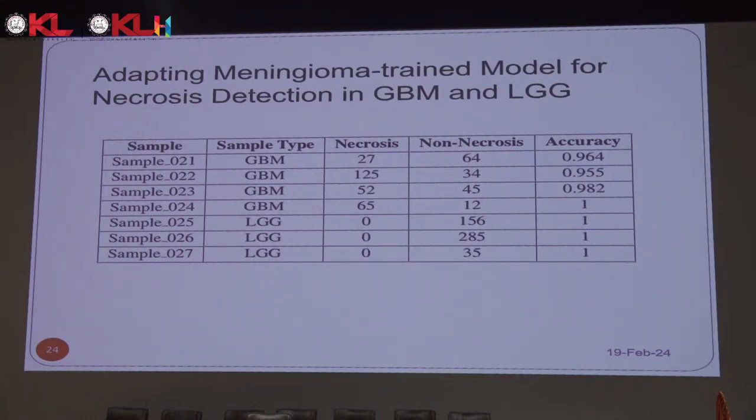Dr. Rose was speaking about glioblastoma on the radiomic side. We are trying to do it on the histopathology side. The TCGA has glioblastoma slides. We trained on meningioma and just tried to predict. We want to know if the same models can be used across different brain tissues.